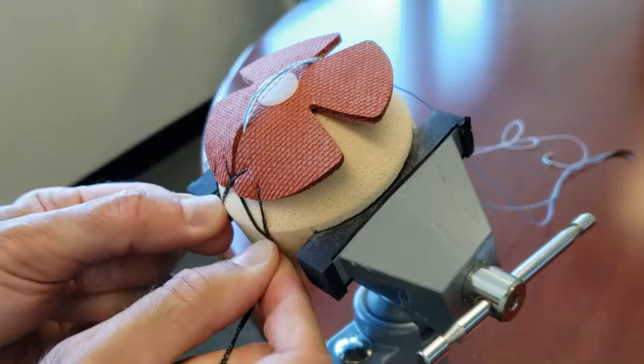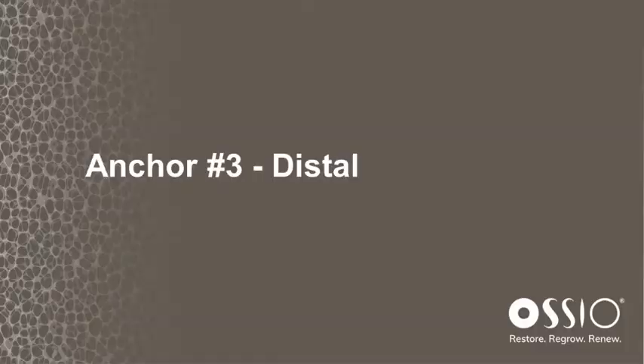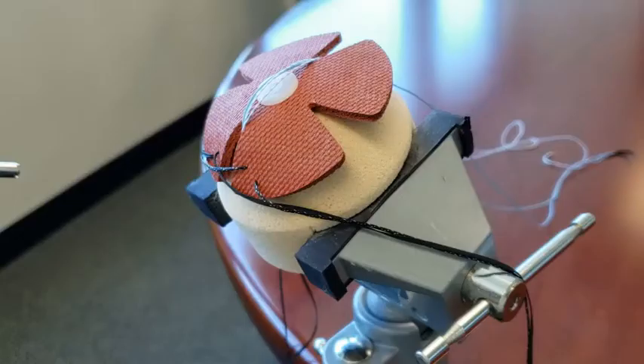At this point you can cut the needles — cut as close to the needles as you can because you use those limbs for suture passing. Now we're going to place the distal anchors. You're going to do this the same as before by drilling using the drill, drill guide, and drilling to a positive stop.